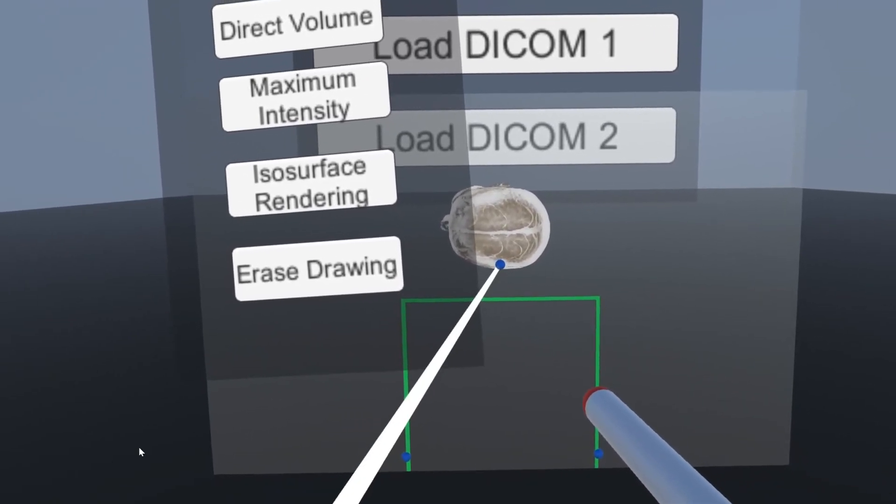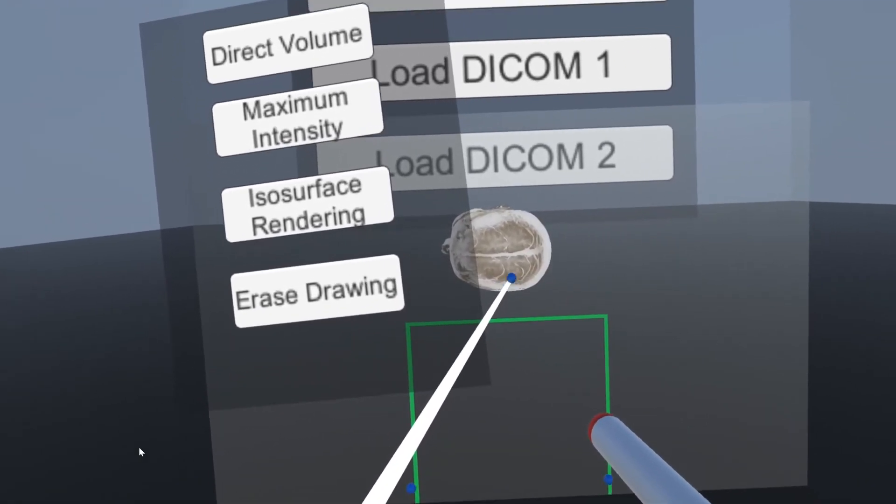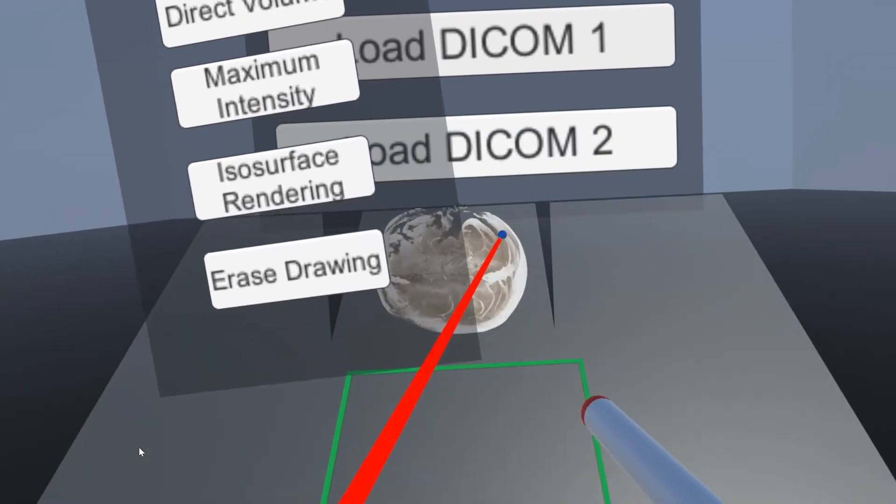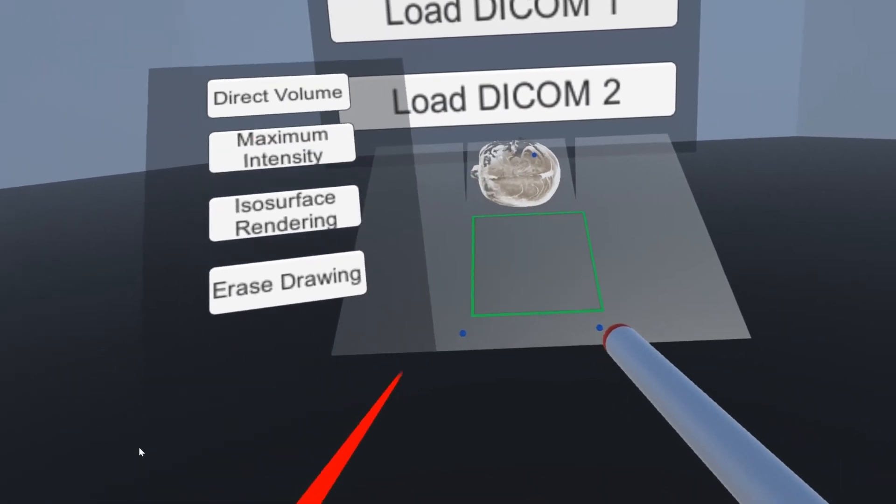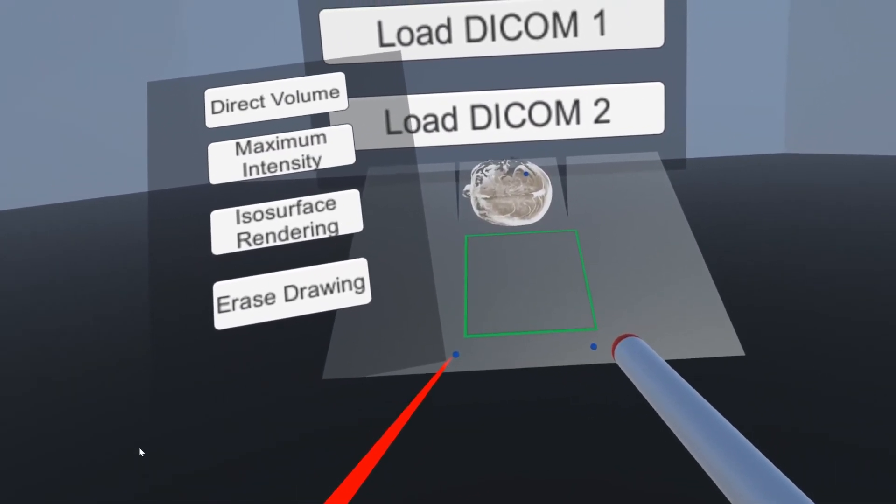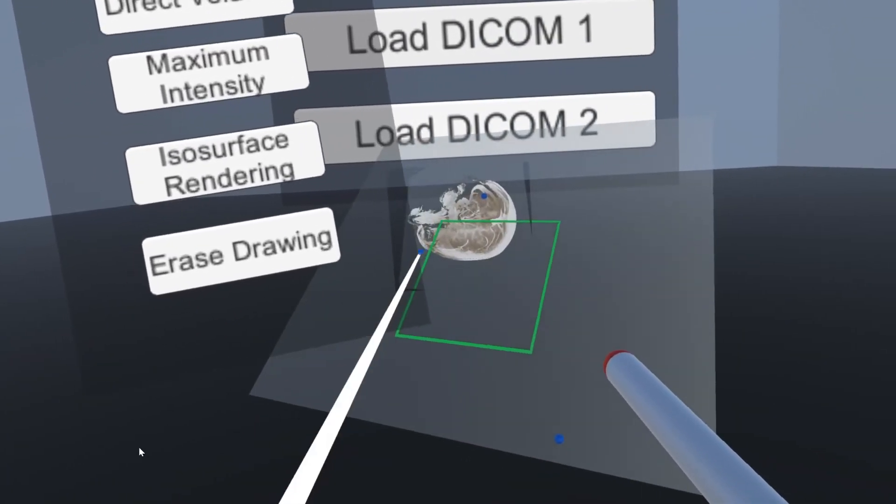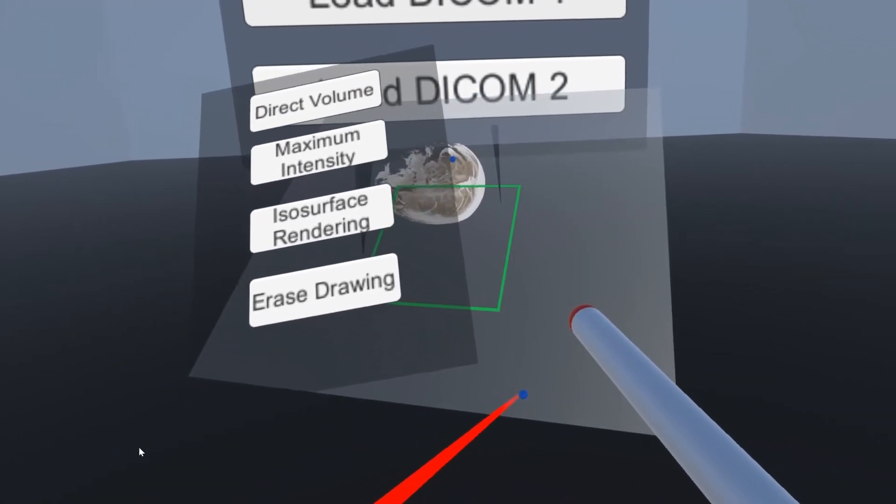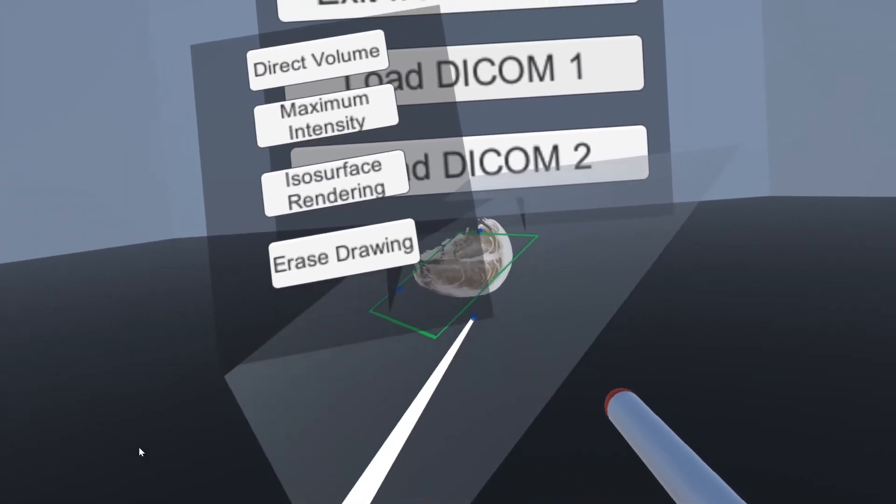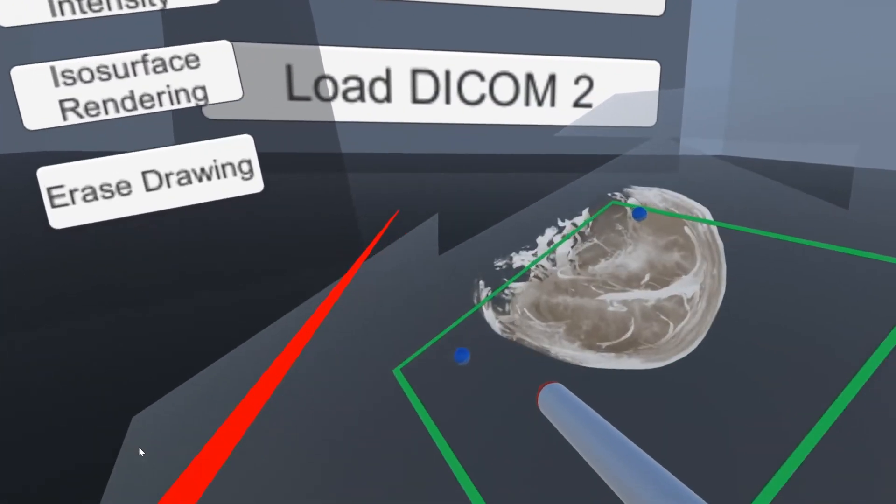First is this planar cut which they can use to get a cross-sectional view of the scan, right here.